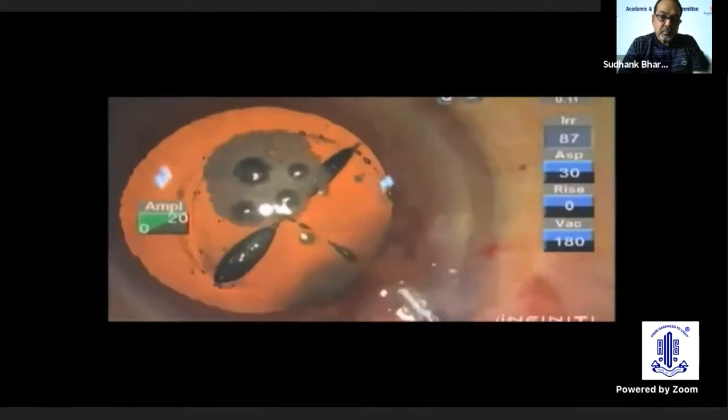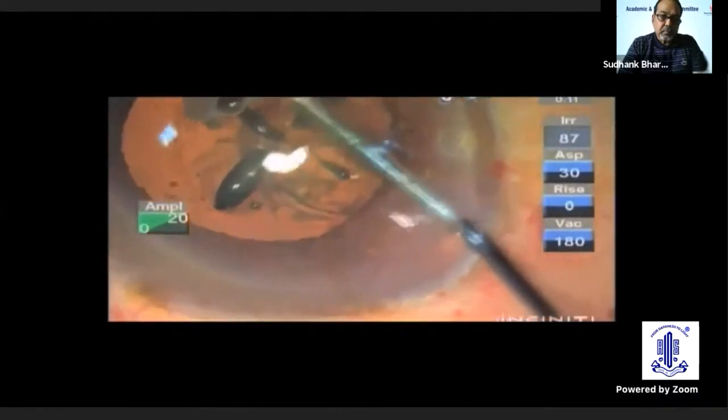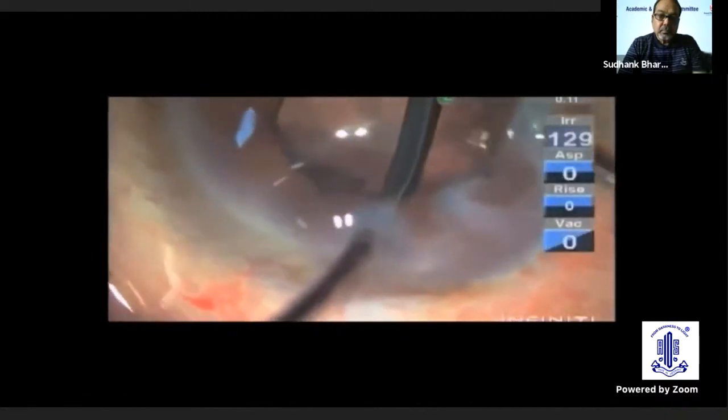Here is an interesting case of femtolaser cataract surgery. The main port is opened and visco injected to reveal a free floating capsulotomy. A routine maneuver to manage the nucleus is done with the default phaco settings when a posterior capsule defect is recognized. This is presumably caused by the laser cutting beam up to the posterior capsule.